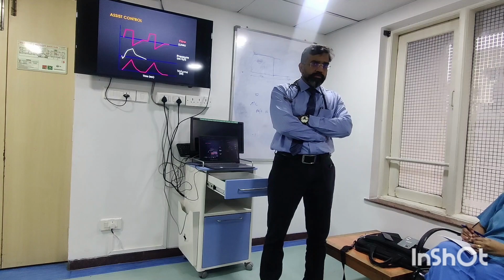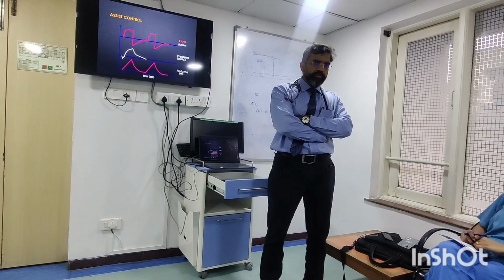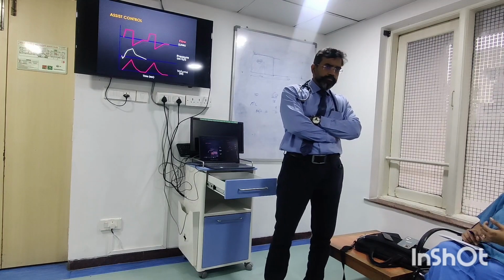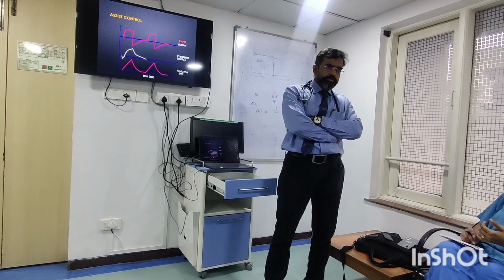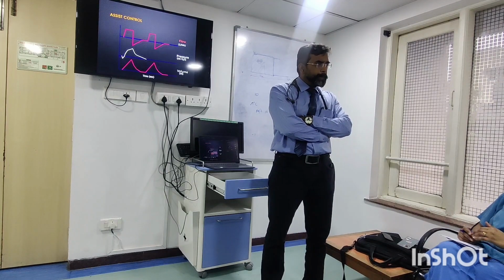That huge amount will be delivered, sir. What would happen to the breath? CO2 also. What would happen to the breath? Forget about what's going to happen to the patient. If the patient triggers 20 times, what kind of breath will be delivered? You will take constant volume. So he says constant. What about you, Nikhil? Yes, sir. We also said it is volume limited.